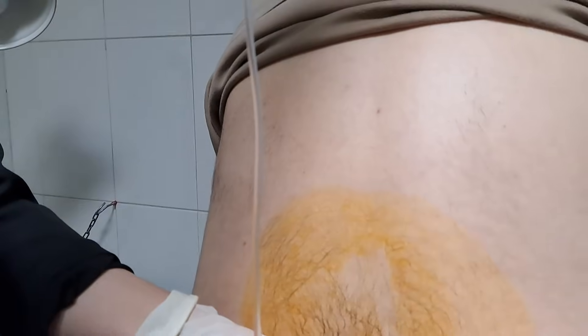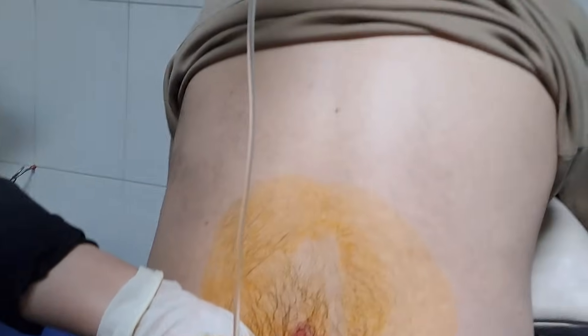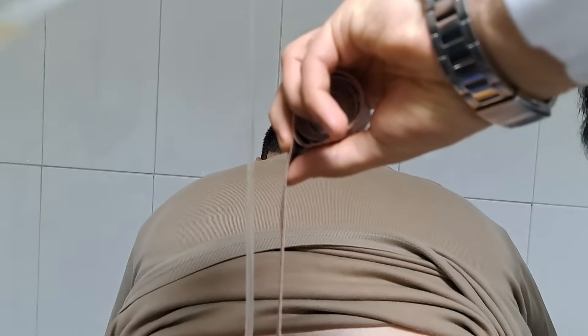If we don't have access to a manometer, we just use a tube and measure the height using a ruler. This may not be completely accurate, but the error is not considerable.